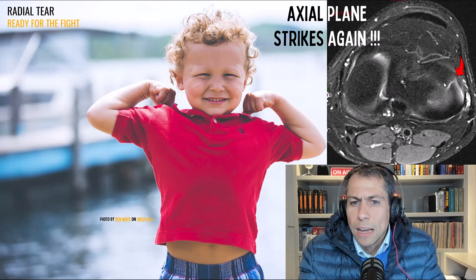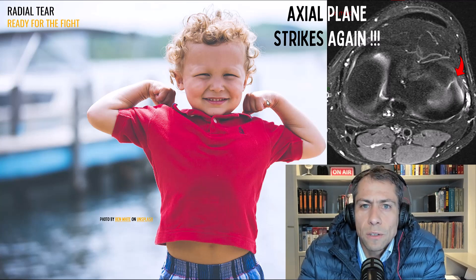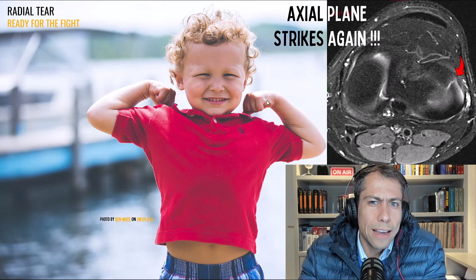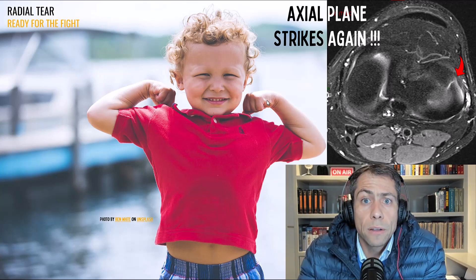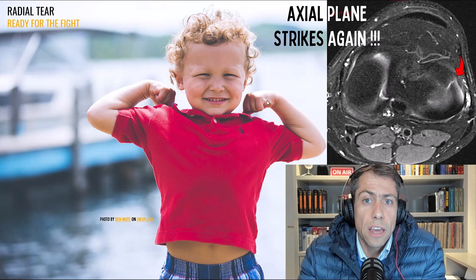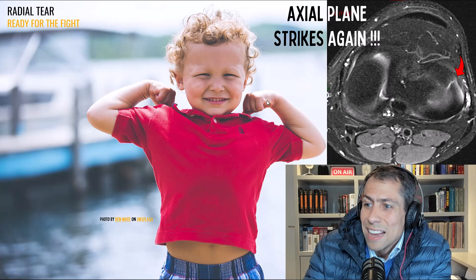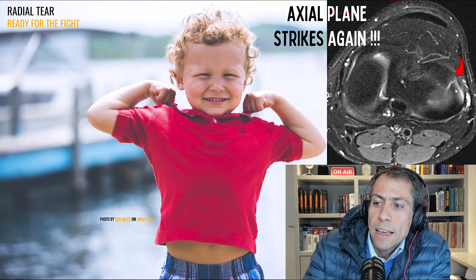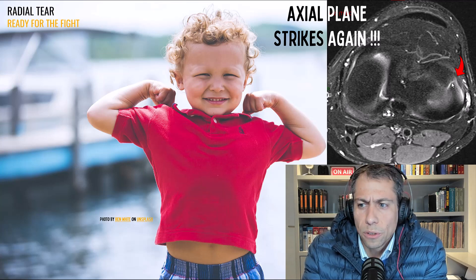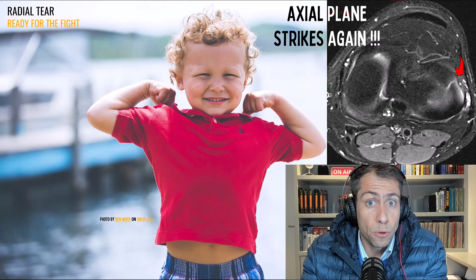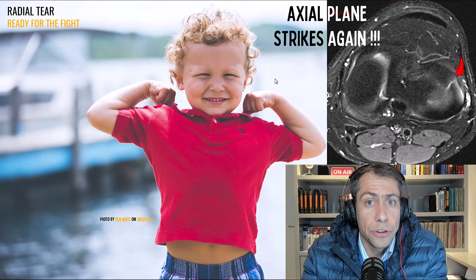I'm approaching the end of this video. I showed the findings of partial radial tears with the Casper sign or meniscal truncation. If you see a meniscal truncation, don't think only about the partial radial tear — there are other lesions that can cause truncation of the inner portion of the meniscus. Be aware of radial tears in the transition zones between the anterior horn and meniscal body, or meniscal body and posterior horn, because they are hard to identify. Use and abuse the axial plane to identify radial tears, especially in these regions.